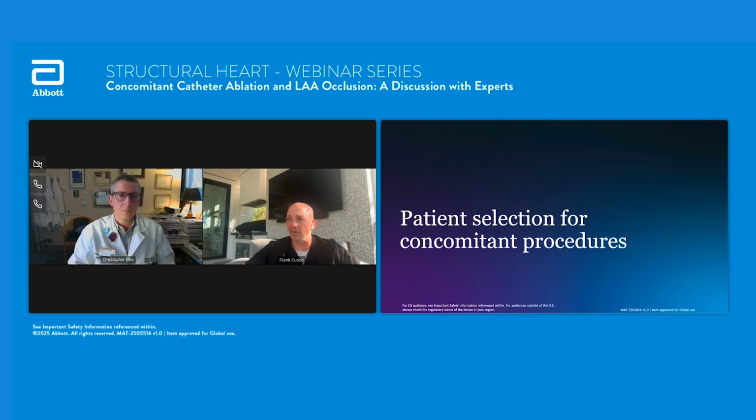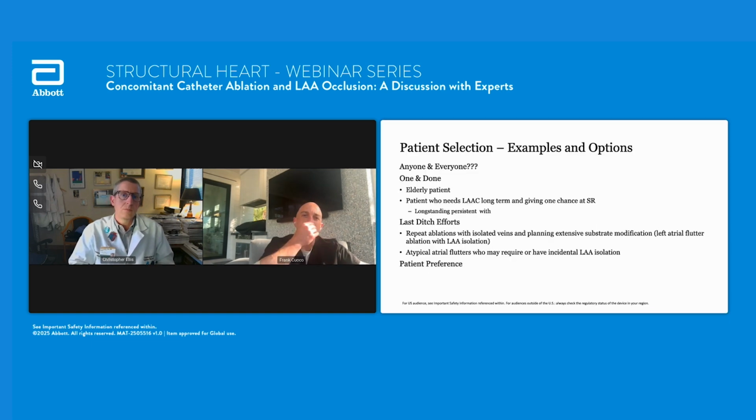But I certainly see a major shift in our practice. Chris and I were actually talking offline prior to this webinar, and we both agreed we're doing a lot more concomitant than we ever thought we would. We're finding now that there are many patients who want this, patients who really benefit from this, and it makes sense to do these procedures at the same time.